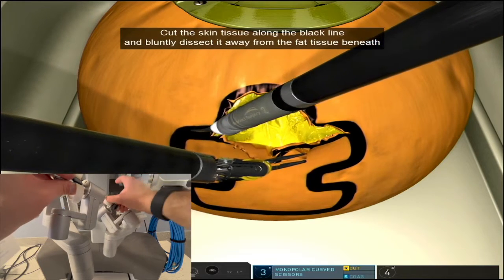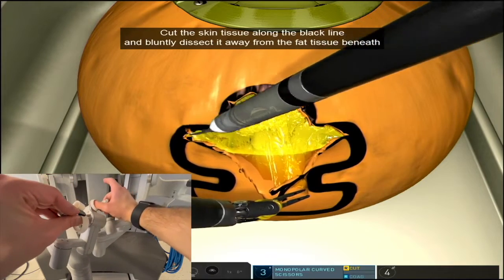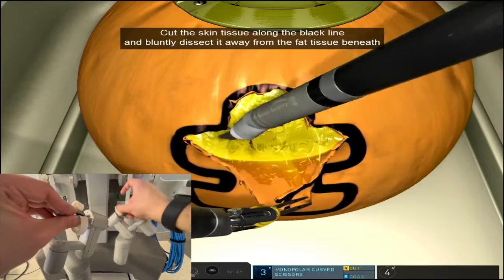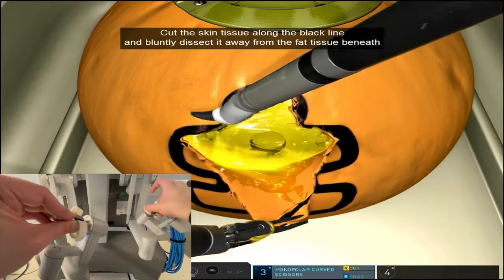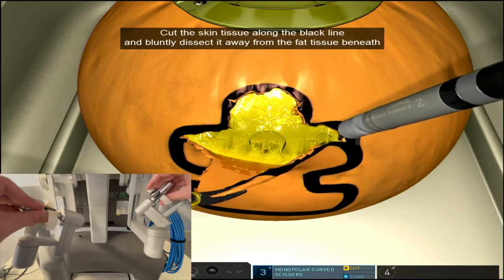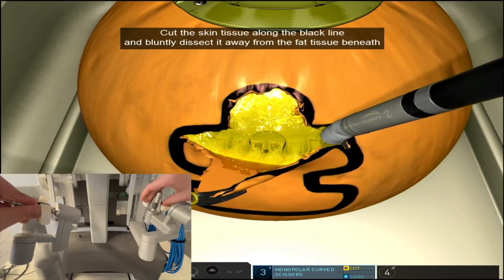Try to be a little strategic when it comes to cutting that piece of tissue off, and it's okay to take a little bit of extra time. See how I'm trying to detach the piece as we go, so that I can lift it off the base of the tissue with greater ease.